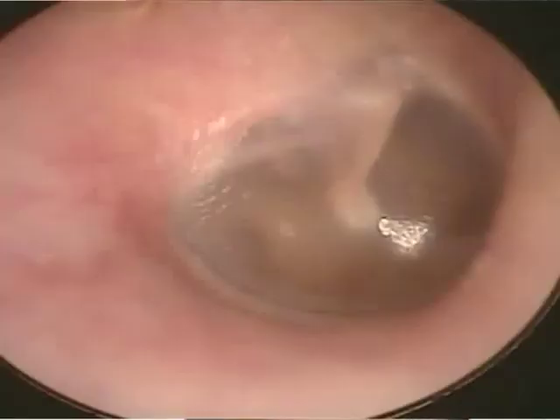But when we do the inspection of the tympanic membrane, we must look for the following normal findings. The color of the tympanic membrane is supposed to be pearly gray, shiny, and transparent. We also look to see if there are sections of the malleus bone visible.